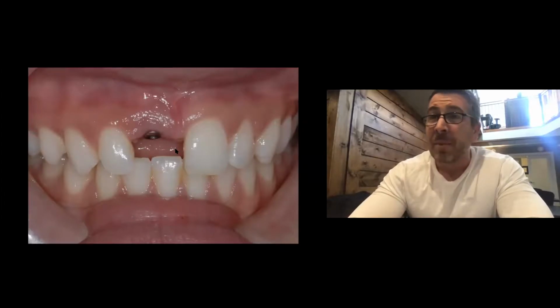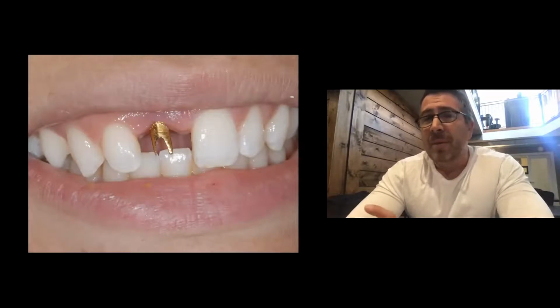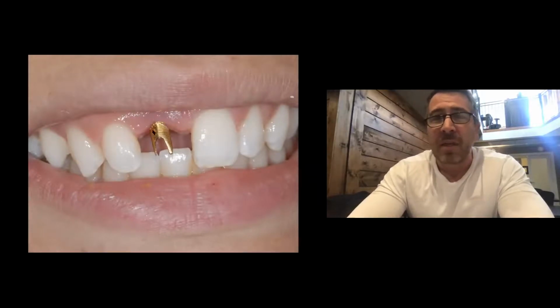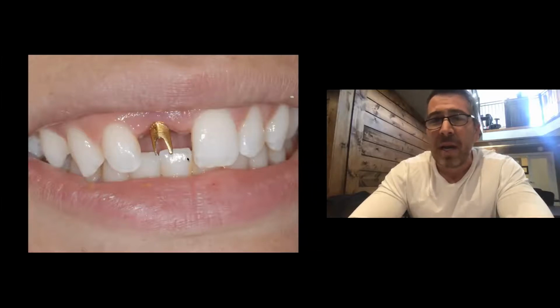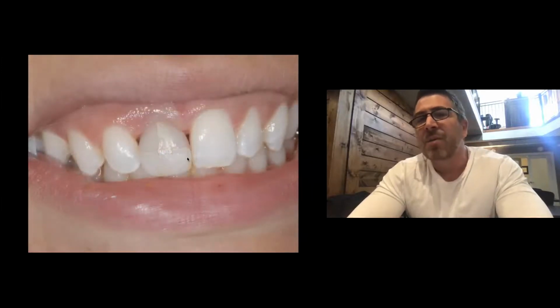you ask them to make you an abutment and crown. Now this is what they give you. They give you a piddly little abutment with no emergence development. Now if you look at this abutment, you can already tell that it's not going to change where the zenith is. How am I going to have an emergence toward the mesial coming over to the 2-1? It's not going to happen. It's going to give me an ugly result like that.